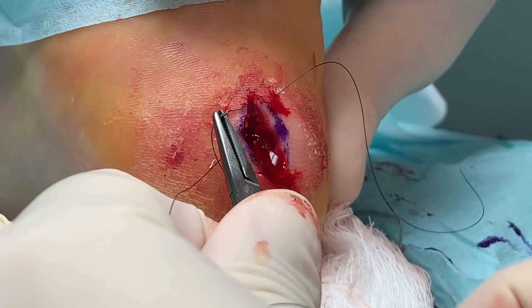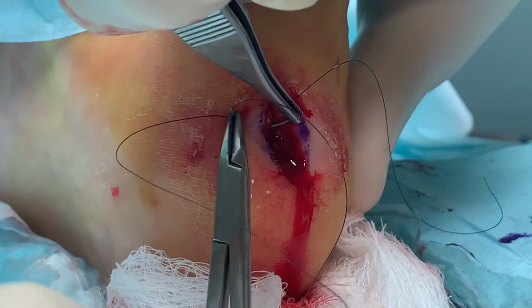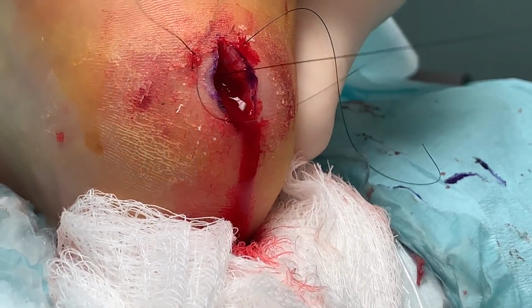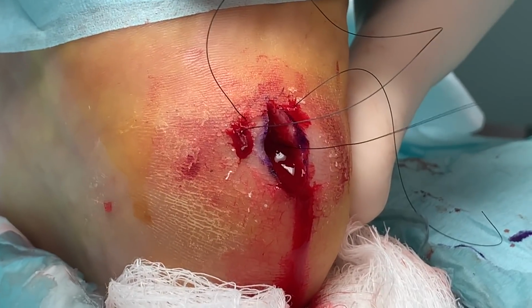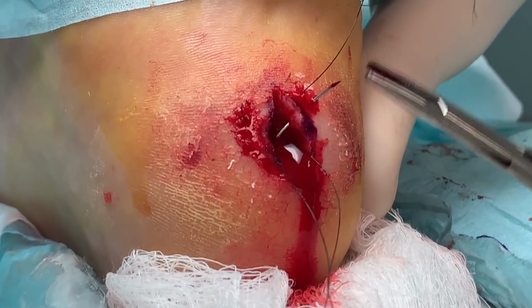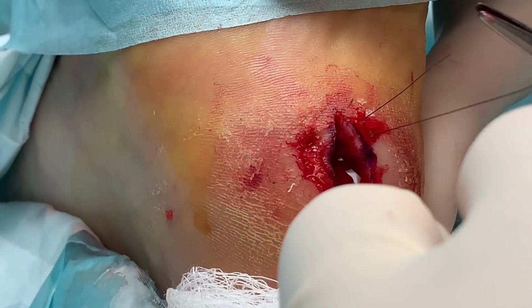So we're gonna throw some horizontal mattress sutures here. That way it's a little more sturdy. Helps it heal a little bit better too. I forget the exact science behind it, but that's what I learned in plastic surgery. Feeling better? Good. Anything to help him heal it better at this point. Just to be clear, imagine an eggshell on the bottom of your foot, right where this is. You walk on it, boom, it's gonna bust right open.